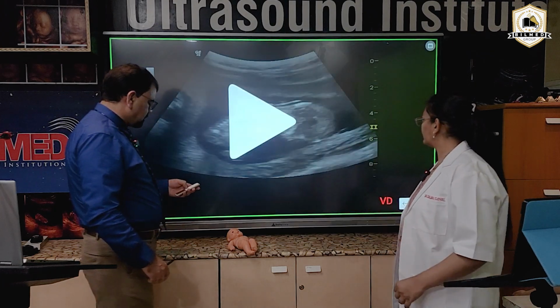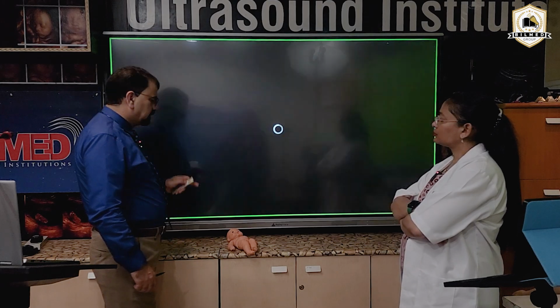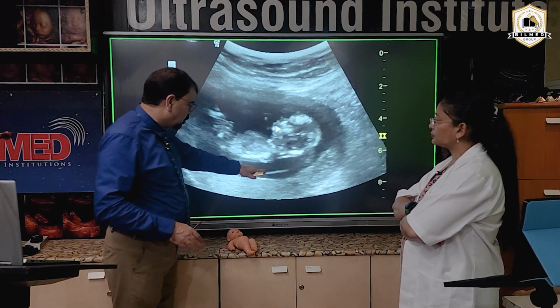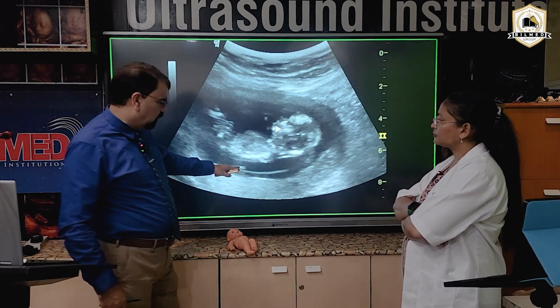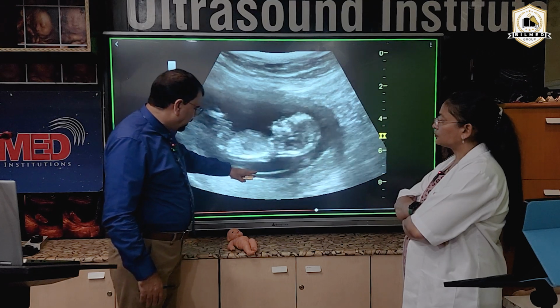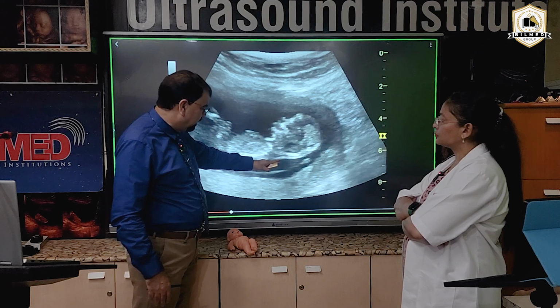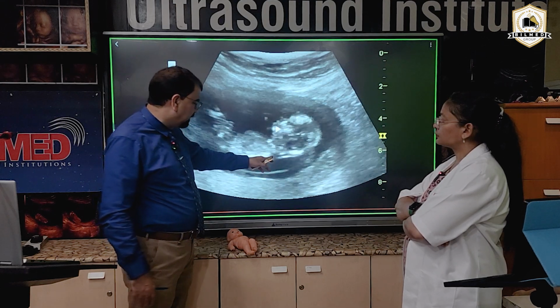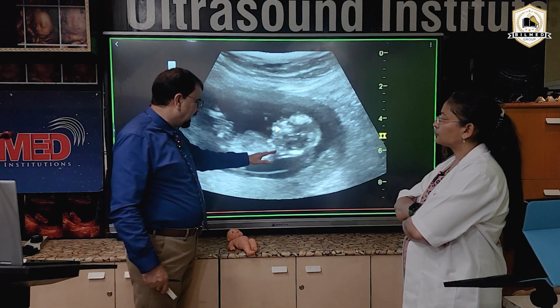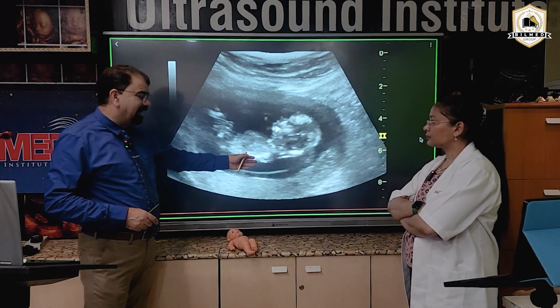Now, pay attention over here. Sometimes I am having an amnion also in the section. See, this is the amnion over here. If I take this as NT, when you measure it, it will come out, of course, abnormal. Now, how to differentiate whether this is an amnion or an NT?